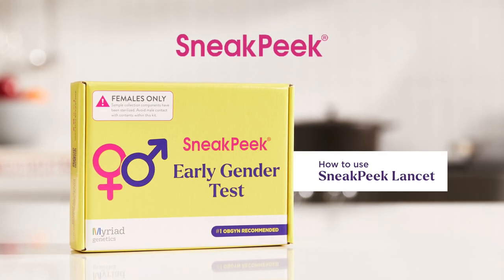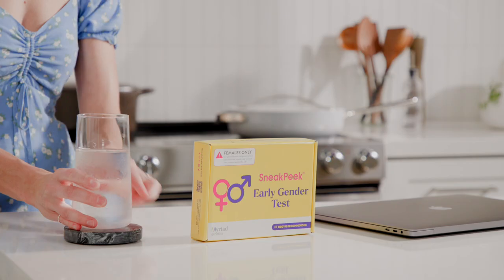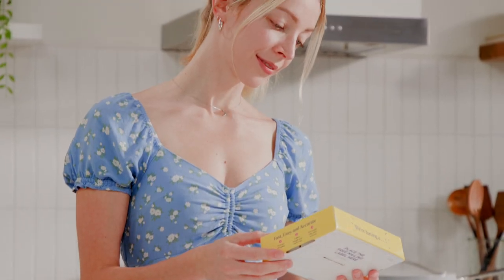Welcome to Sneak Peek, the earliest and most accurate way to learn your baby's gender. In this video, we'll show you how to take the Sneak Peek Lancet DNA blood test to get the best results and reduce the chance of male DNA contamination.